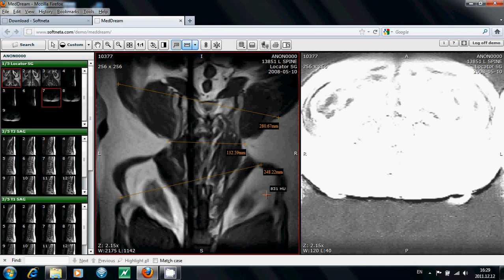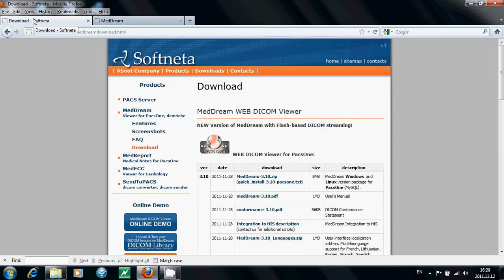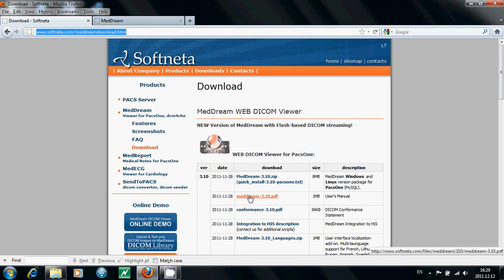If you want to know more about the measurements and other MedDream functionalities, go to www.softneta.com and download MedDream's user manual.